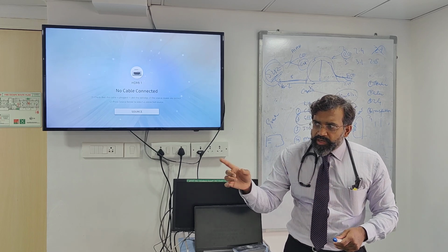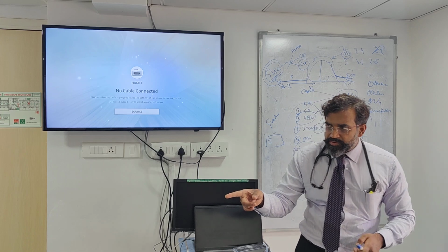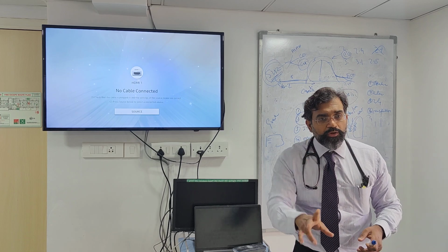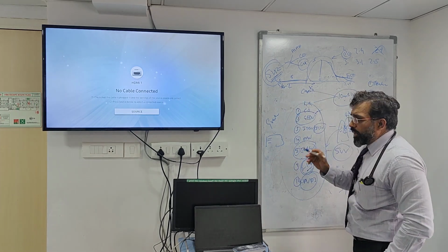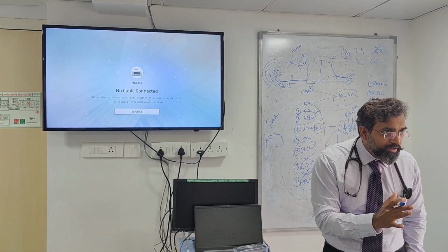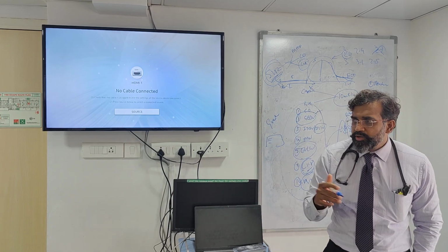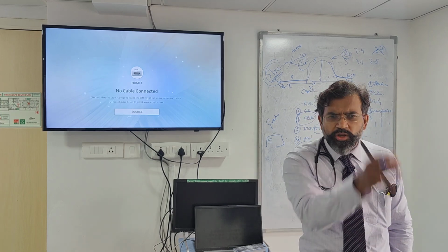So you can do it in arrhythmia, which you said is a contraindication. No, it's not. When you are doing your first thermodilution, it will give you the most accurate report. The arterial pulse contour analysis may not work in arrhythmia, but thermodilution is the gold standard for arrhythmia. You understand what I'm saying? When you're doing thermodilution, you will actually get all your values.